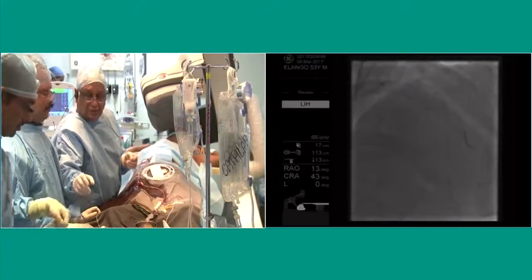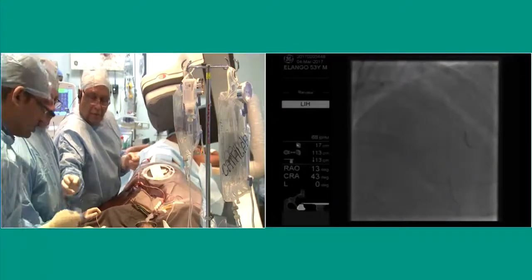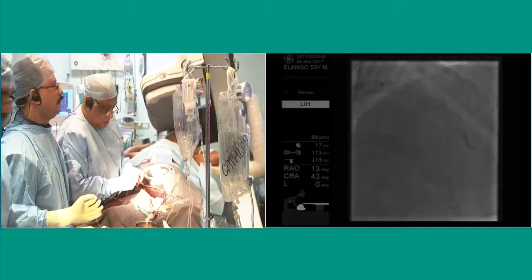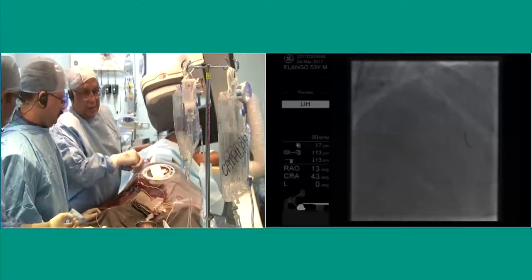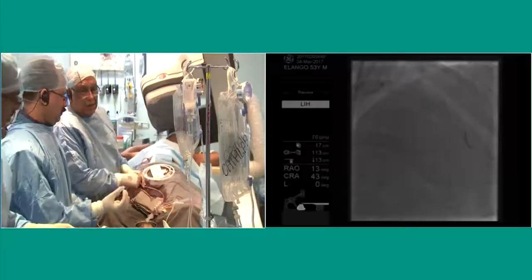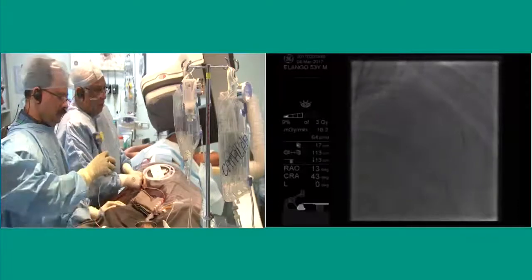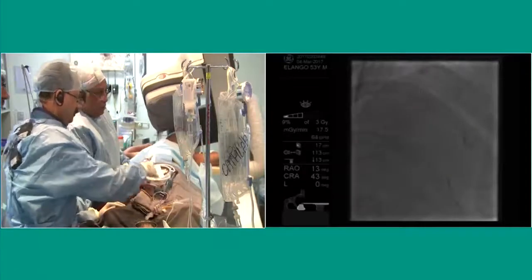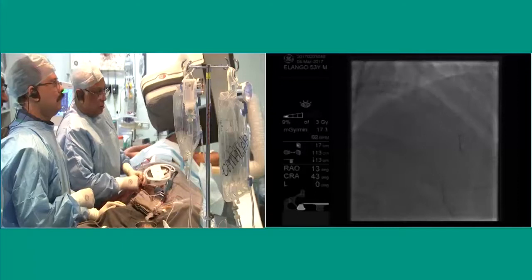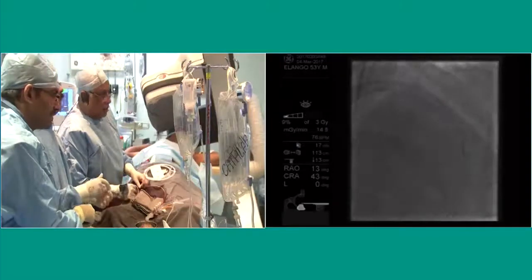Mathew, post-dilatation. I was personally feeling that you probably have undersized the stent, and certainly before this diagonal, you really need to go up with a 2.75 to higher pressures. Do the proper POT, because I think you're undersized for that vessel. Remember, we were seeing this. That area at the level of the diagonal. I will show you again. It is a 2.5, 2.6. Before I do that, I can always go back and do the POT. Okay. Diagonal, go up.